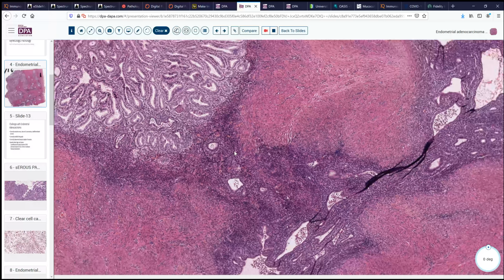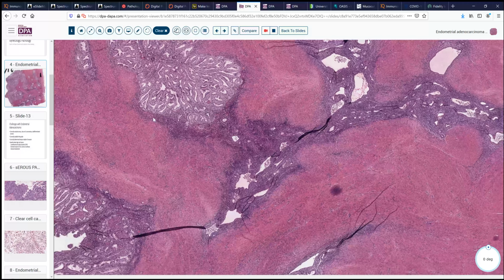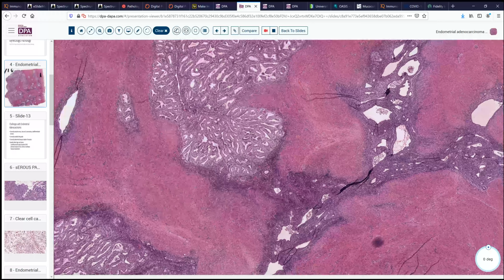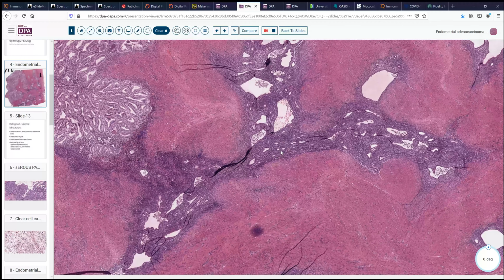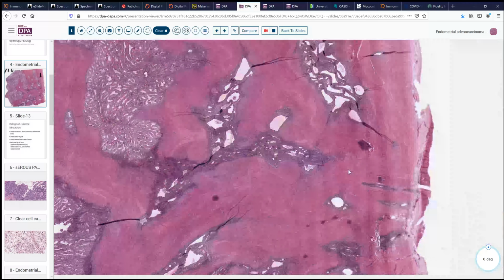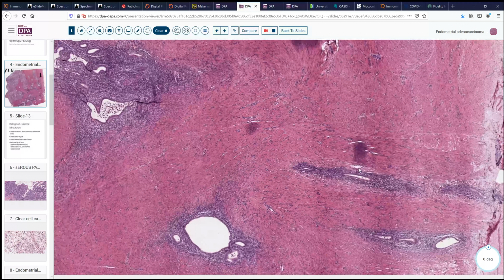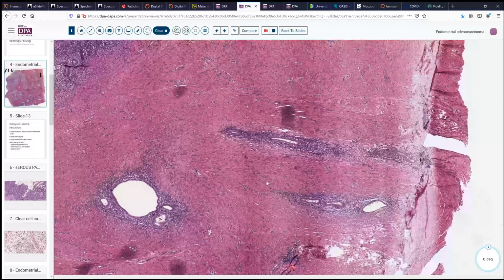Well, the other feature that we see here is a blue stroma admixed with these glandular tissues that says this is adenomyosis. So this bluer tissue is adenomyosis, and because we have a little bit of that blue tissue surrounding these invaginating tufts of tissue, this is actually adenocarcinoma that is extending down adenomyosis partway through the myometrium. Now, as we can see, this adenomyosis is present elsewhere and extends well into the myometrium, nearly to the serosa, as we can see here. Here are benign endometrial type glands surrounded by stroma, right out to the level of the exterior surface.